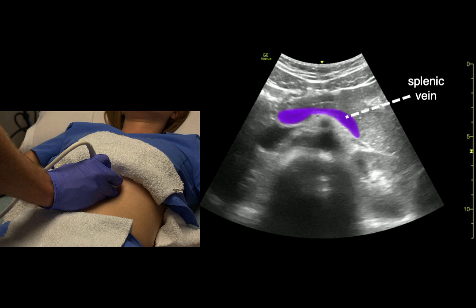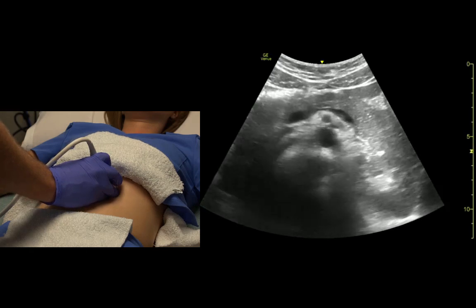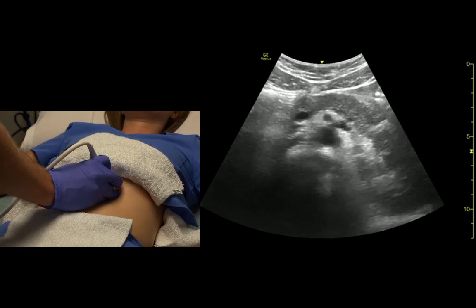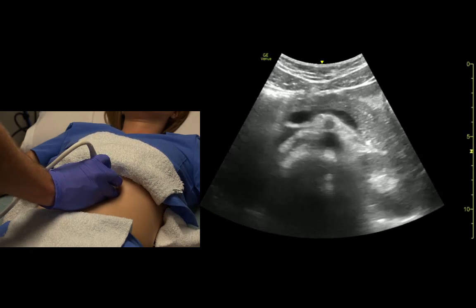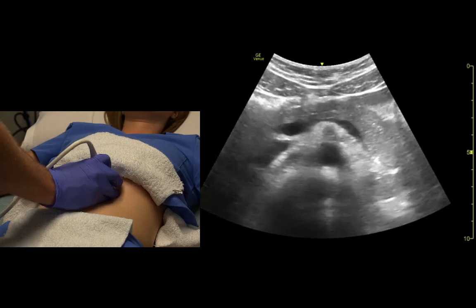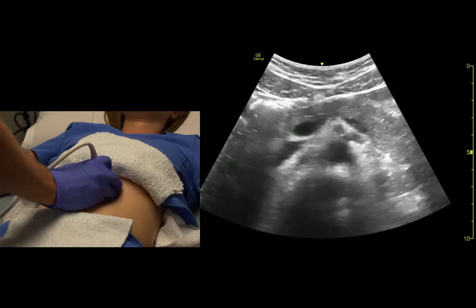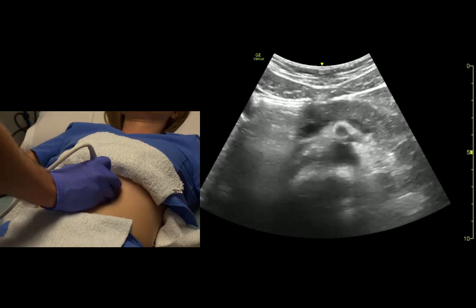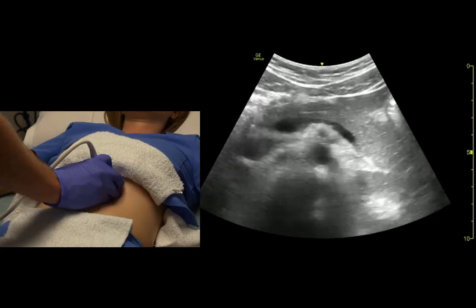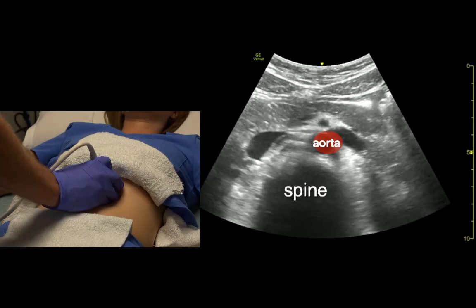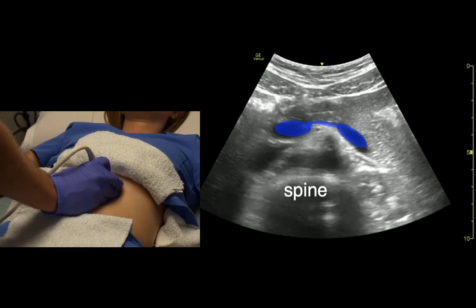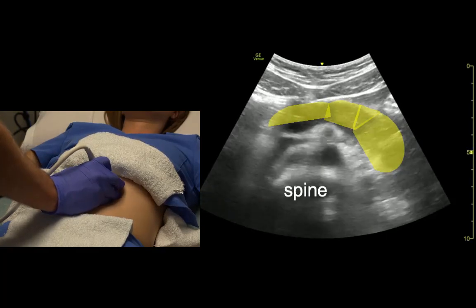The splenic vein runs over the top of the superior mesenteric artery. All that gray tissue on top — that's pancreas. So we have: spine, aorta, SMA, splenic vein, pancreas.